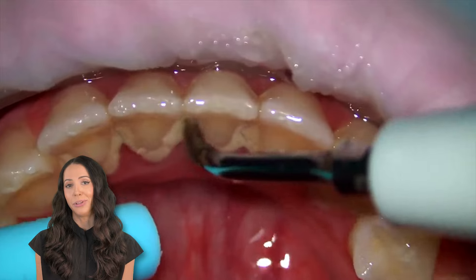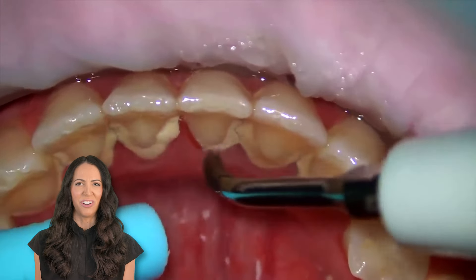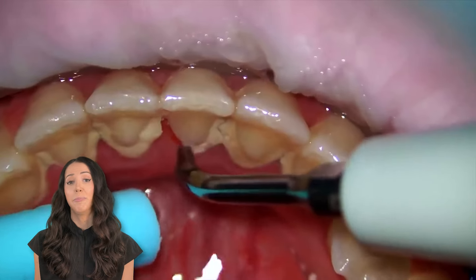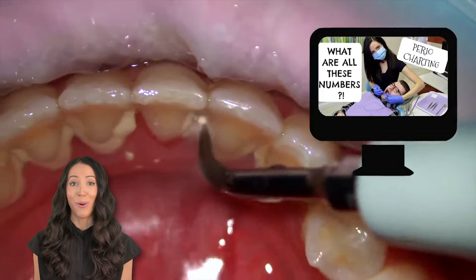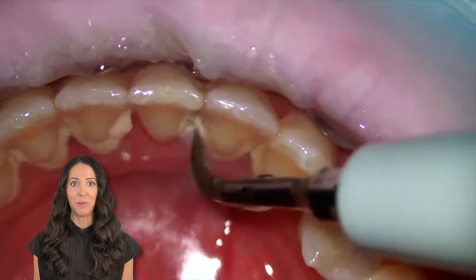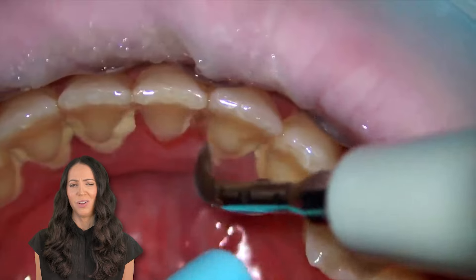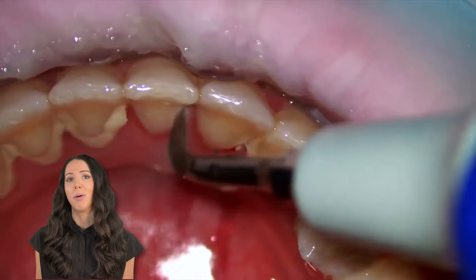This right here may or may not be a deep cleaning. We generally call it a deep cleaning when there is tartar — we have tartar, we can see that — but there also needs to be pocketing. I didn't get to see the perio charting numbers for this patient, and without knowing whether there is bone loss, and without x-rays and without the perio charting, I'm unsure if this is a true deep cleaning or if it's just a scaling in the presence of gingival inflammation or maybe even a full mouth debridement.